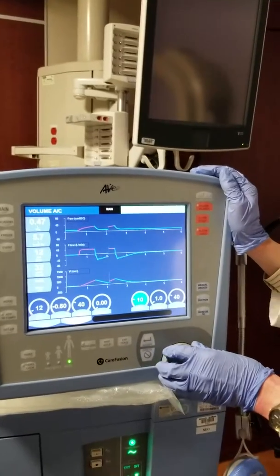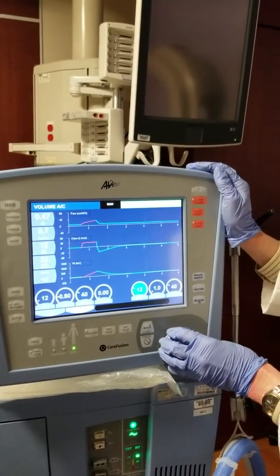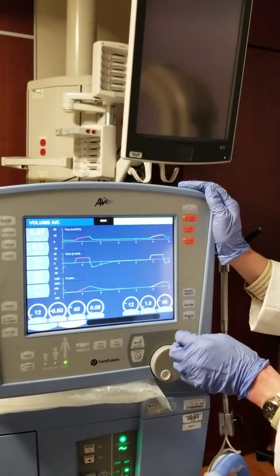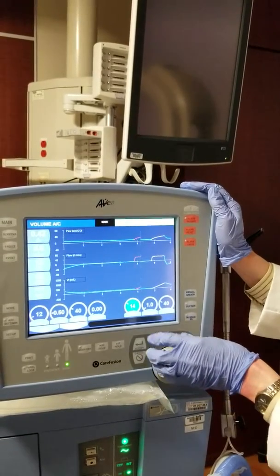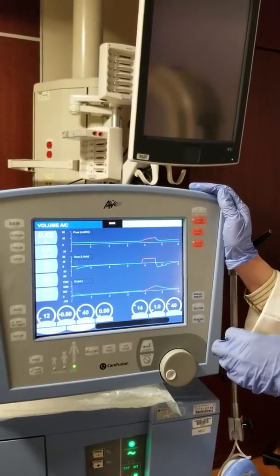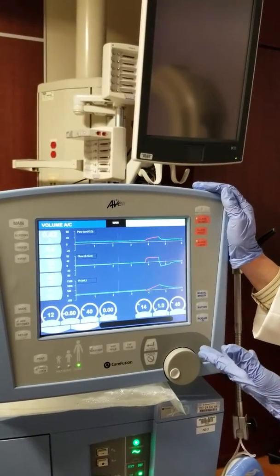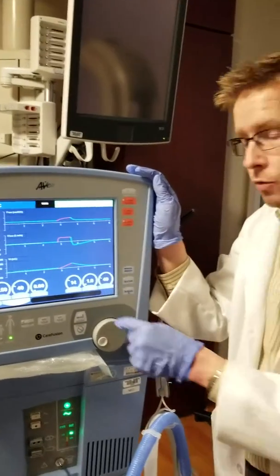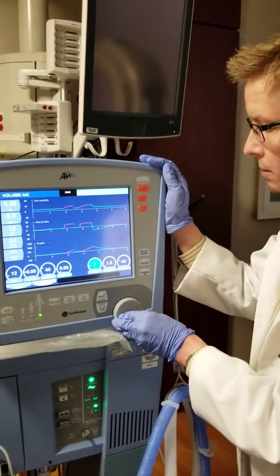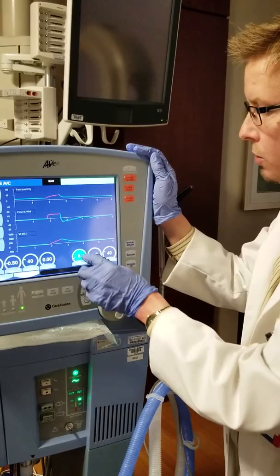We want the neutral zone. And you can see it's kind of starting to flatten out a little bit. Again, this is a plastic test lung. This is not a great subject to try, but you get the idea. So we're going to review real quick, just going to hit all of those talking points.